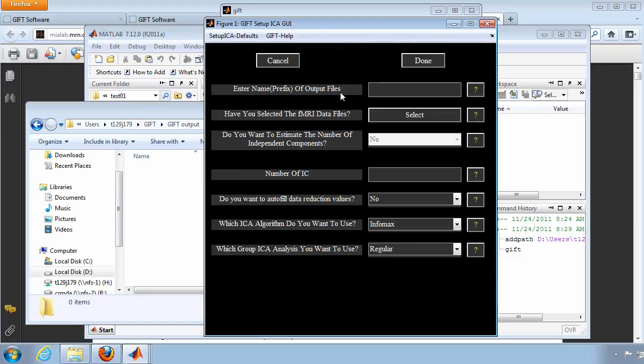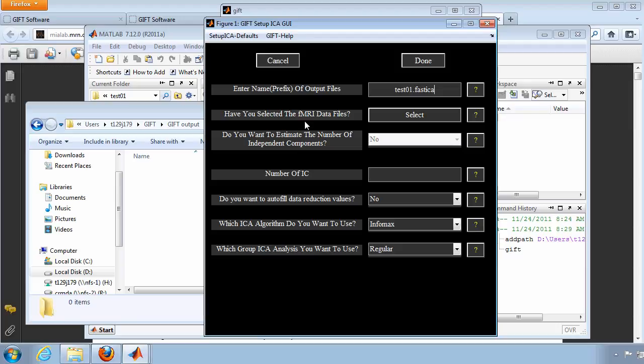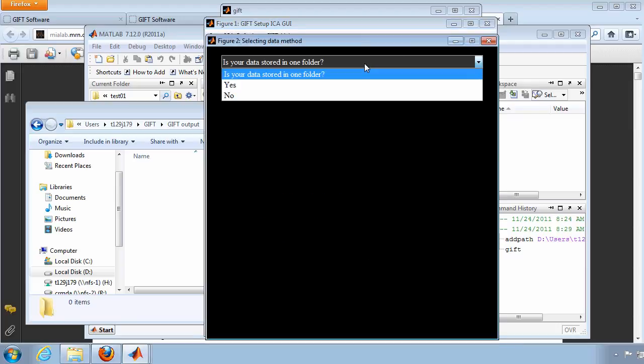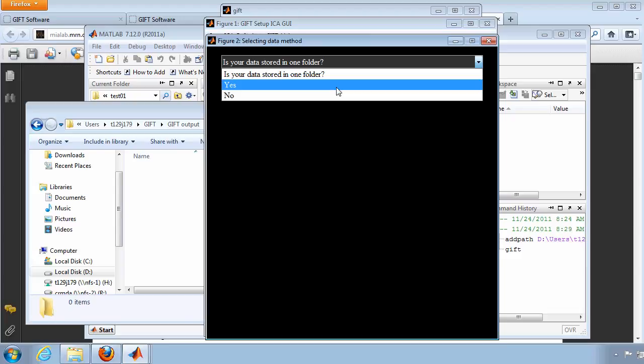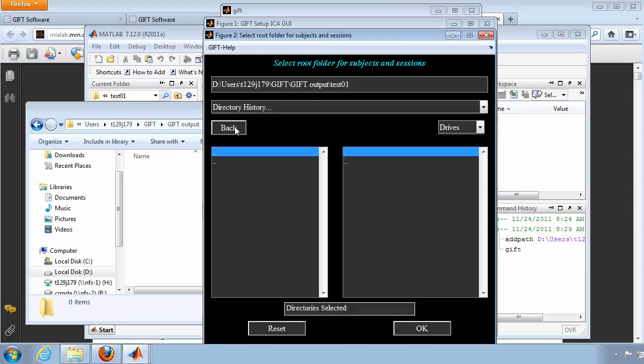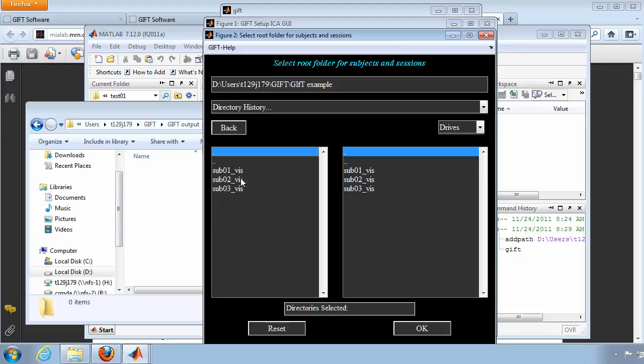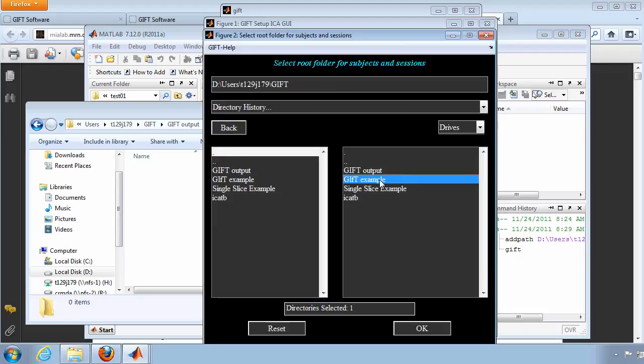I will use the same or similar naming convention for your output files as you do for your output folders. I will use the FastICA algorithm for the first example, so I will include that in the file name prefix. Then, click Select to tell GIFT where to find the FMRI data files. Locate the proper directory by clicking back and selecting the correct folder in the right-hand menu, just as you did before. When you find the folder with three subject subfolders, click back and then select that folder.